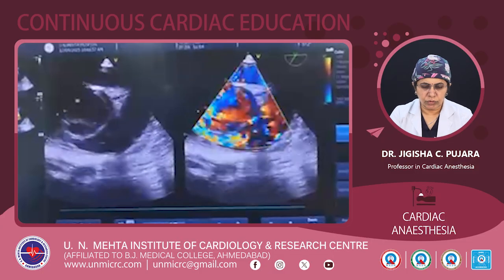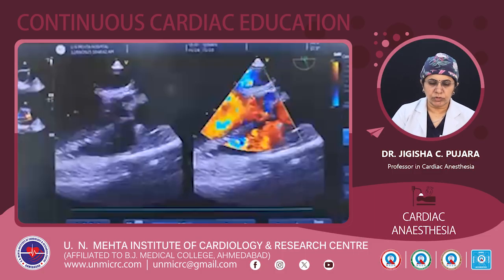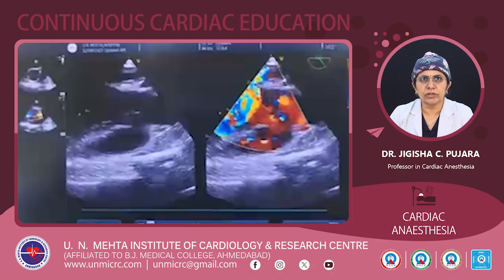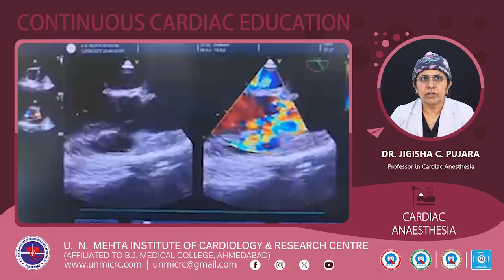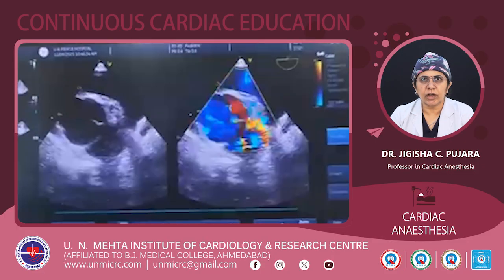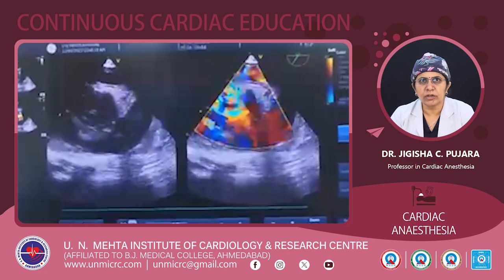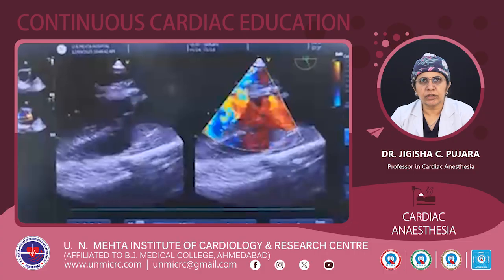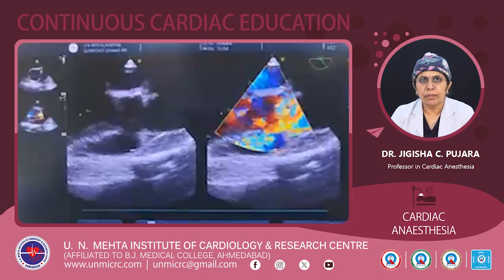And another video here: you can see this outlet VSD along with the vegetation. You can appreciate the vegetation in this view, a small vegetation at the aortic cusp, and severe aortic regurgitation with the outlet VSD. So this is a supracristal VSD.